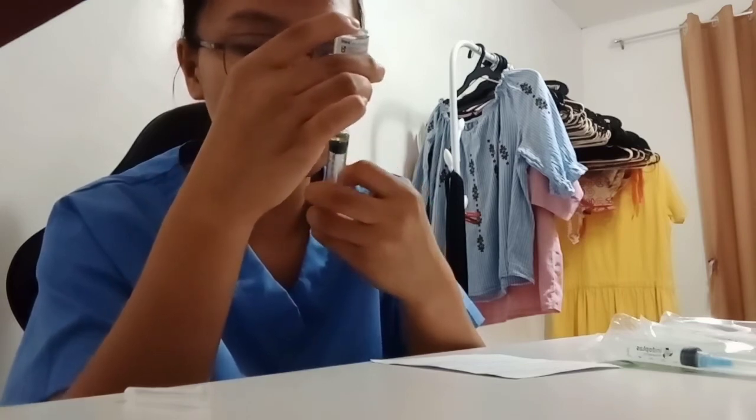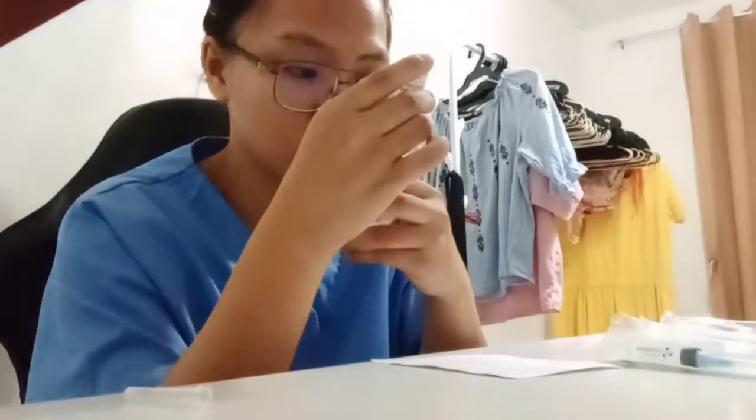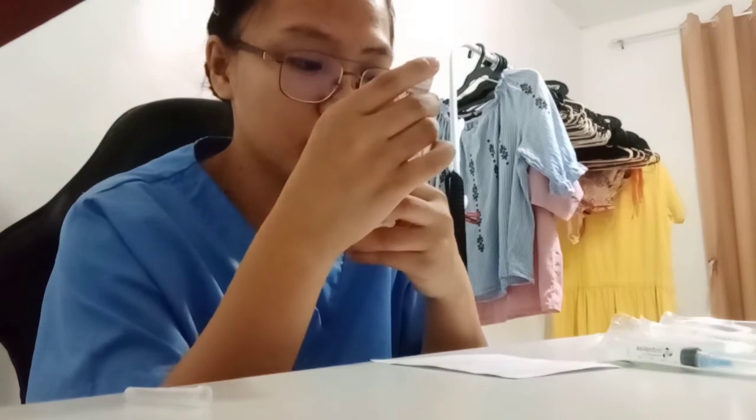Next is to withdraw some air into the top of the vial. Next, if the correct dose is already in the syringe, carefully remove the syringe from the vial.